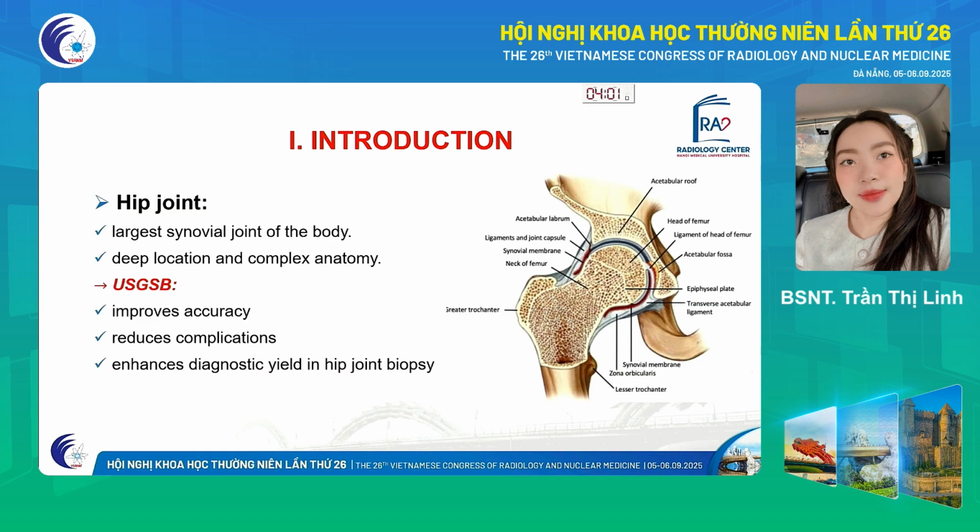The hip joint is one of the largest and most important joints of the body with deep location and complex anatomy. Ultrasound guidance facilitates accurate needle placement, reduces complication rate, and enhances diagnosis in synovial biopsy of the hip.